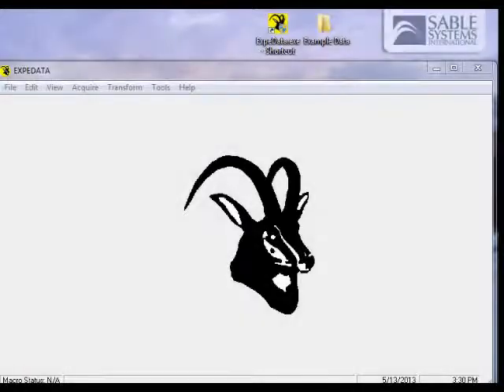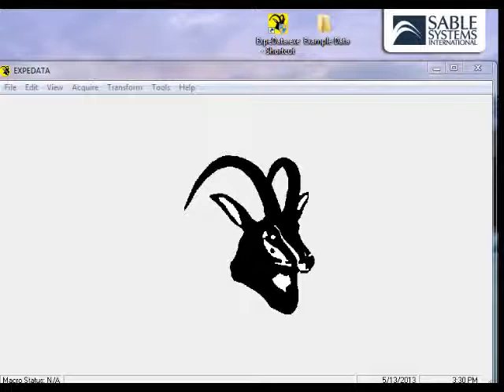This is the main screen of ExpeData. Although the Sable Antelope, after which Sable Systems was named, is quite pretty to look at, you probably want to do more practical things with the program.